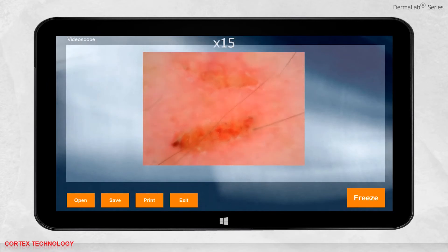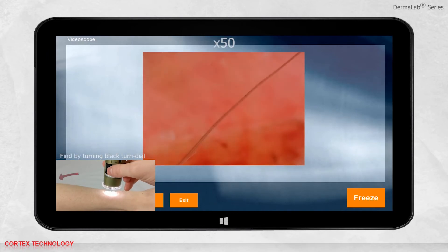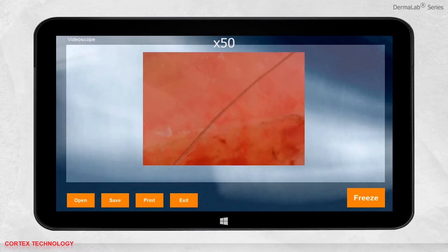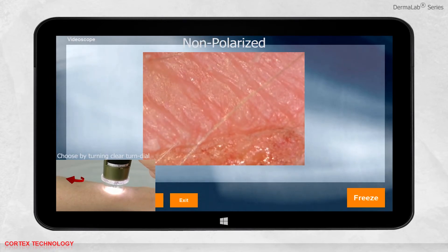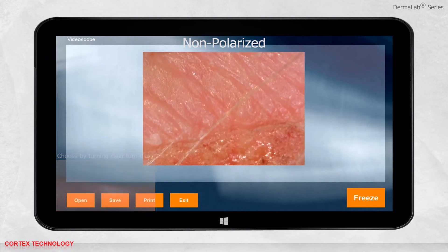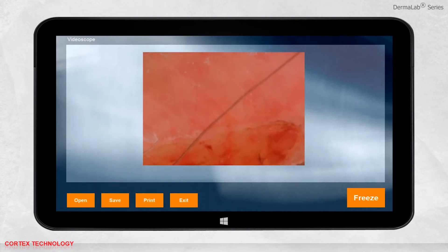The scope has two different magnifications, which you can find by turning the black turned dial. You can choose between polarized and non-polarized light by turning the clear turned dial. When your desired location is found, press freeze to take an image. As always, you can save, print, or open previously saved data.